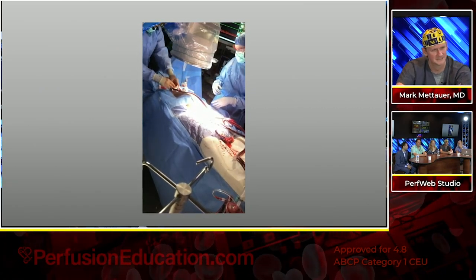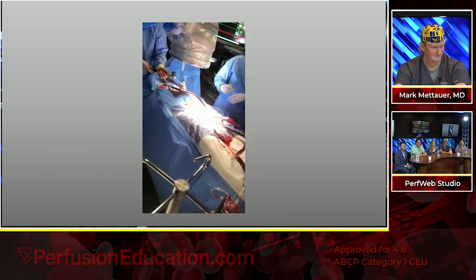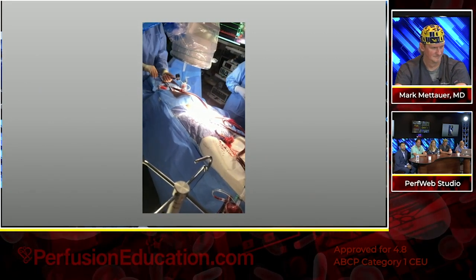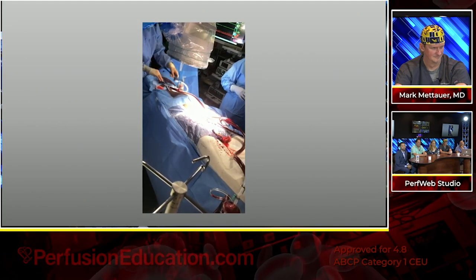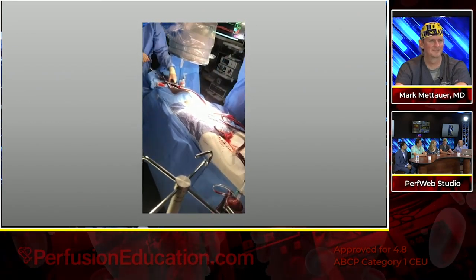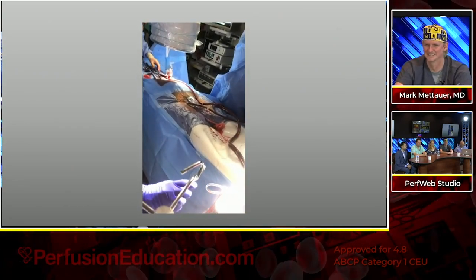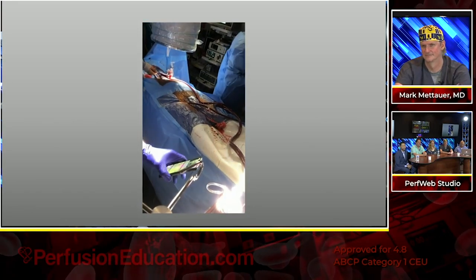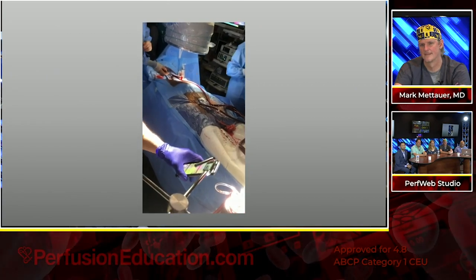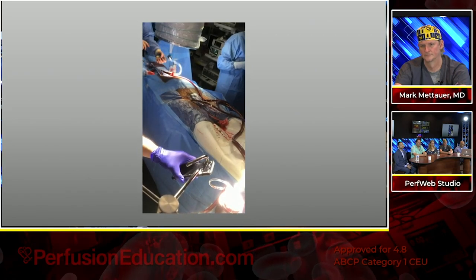We didn't have micro bubbles today. Where are you at? 2,500. I don't care about that error. It'll go right through. It doesn't hurt anything. How far up on this? I forget. Don't turn it down. Okay, it's done. You're good. Now I'm getting flow. I got 5 liters. Somebody give me a flashlight. That was academic, man. We're done. Don't turn your RPMs down, dude. Now my flow's went down to 1 liter. Keep it going. It's still hot. Just keep your RPMs.